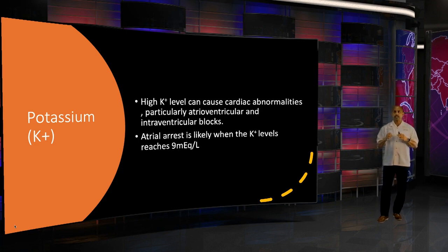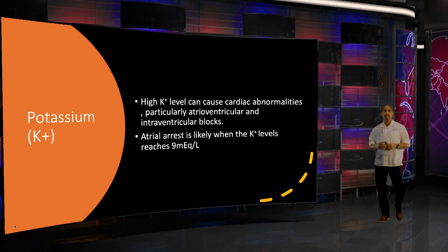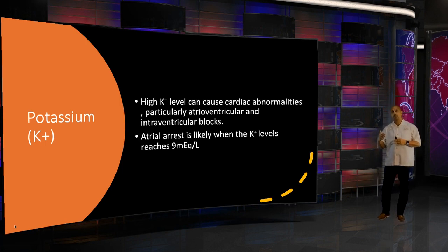You can look to see some intraventricular blocks, AV blocks, heart blocks, things like that. And it could be something like potassium is through the roof. So we're going to dive a little bit more into this as we go through paramedic school, because as I mentioned earlier, in urology, we know kidneys are responsible for filtration. So if my kidneys are not working, then how are you balancing potassium?